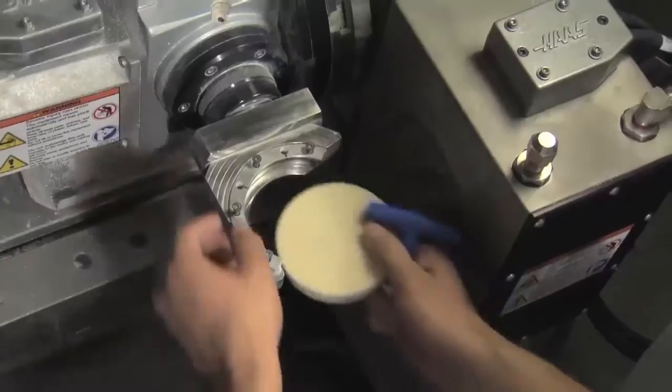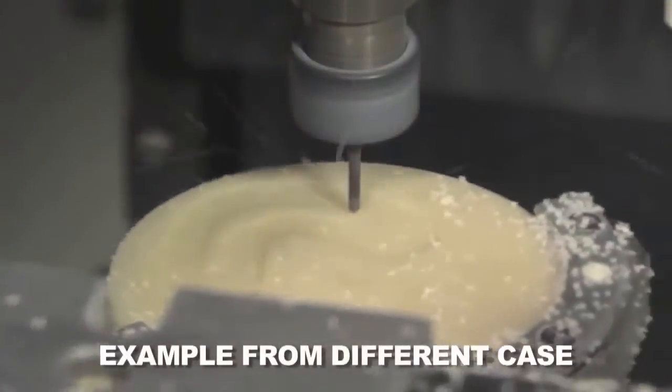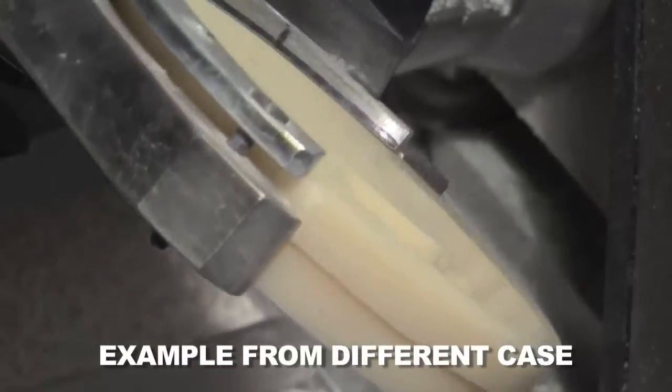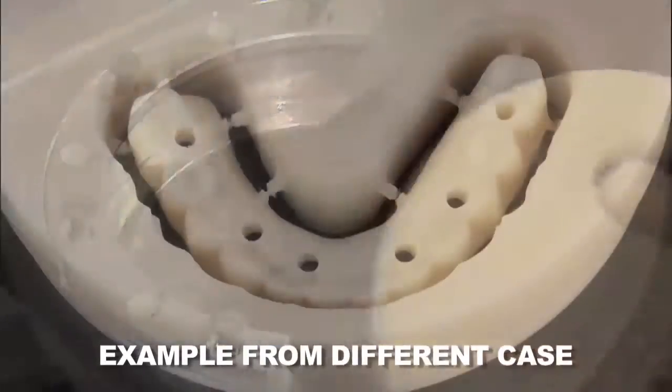Note that an optional provisional implant prosthesis can also be milled from polymethylmethacrylate, or PMMA, to function as a temporary appliance and allow for patient evaluation of the design before the definitive prosthesis is fabricated.